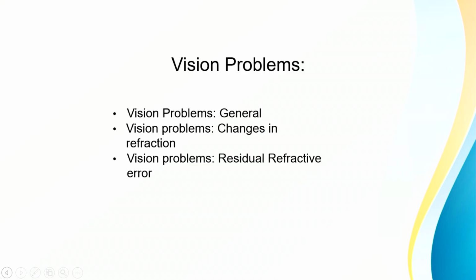So finally, vision problems are very common, and that will be a larger complication than all these things. Vision is not good, but behind the vision problem, all these things will be there. First, changes in refraction can be one thing. If it is not good, changes in refraction can occur. A steep fit can give you a high minus, and a flat fit can give you a high plus. Again, you need to correlate with the fitting.